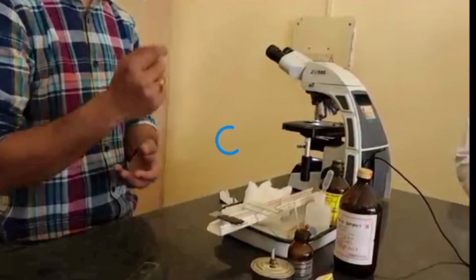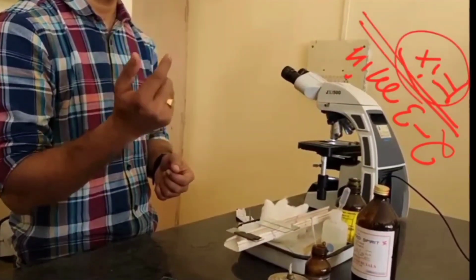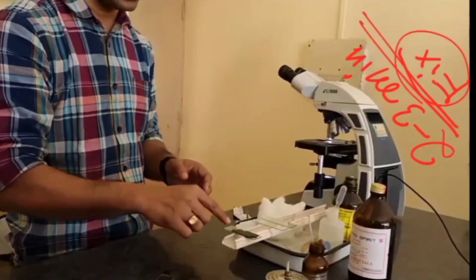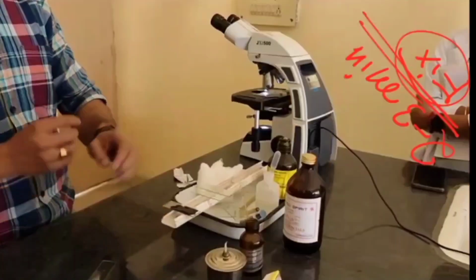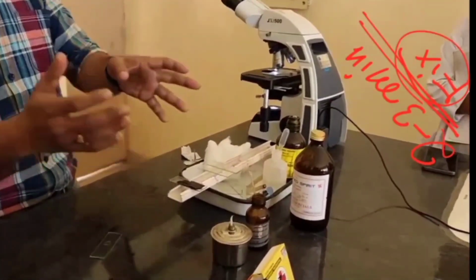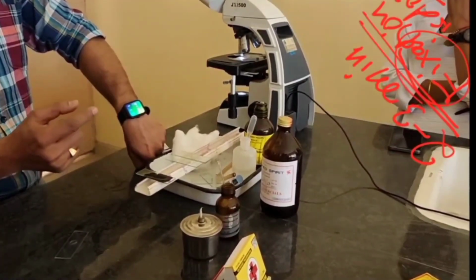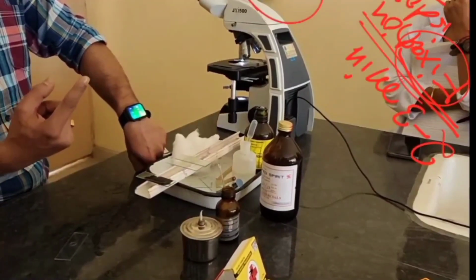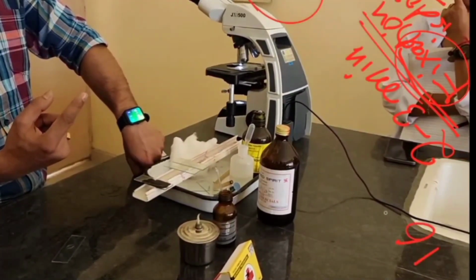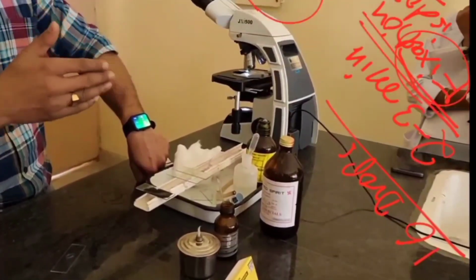Now at this point, how much time do I have to wait? 2 to 3 minutes. Why 2 to 3 minutes? This is the fixation time, to fix the cells or blood film on the glass surface. Now around 2 minutes 30 seconds is over. So fixation is done, and now the next thing I am going to add is distilled water. How many drops? Here I have added 16 drops of Leishman stain, so now we have to add 16 drops of distilled water.